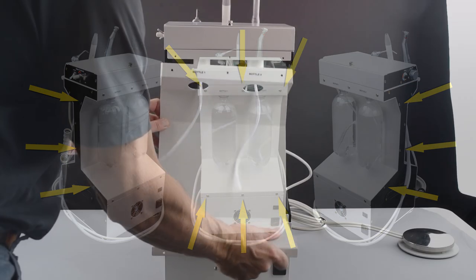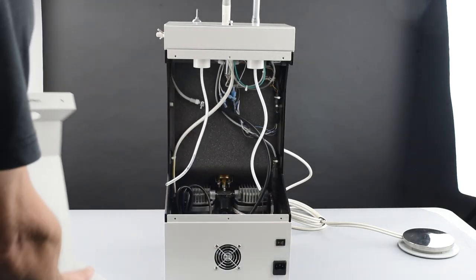Once the backing plate has been removed, the air intake filter will be located on the left side of the compressor.